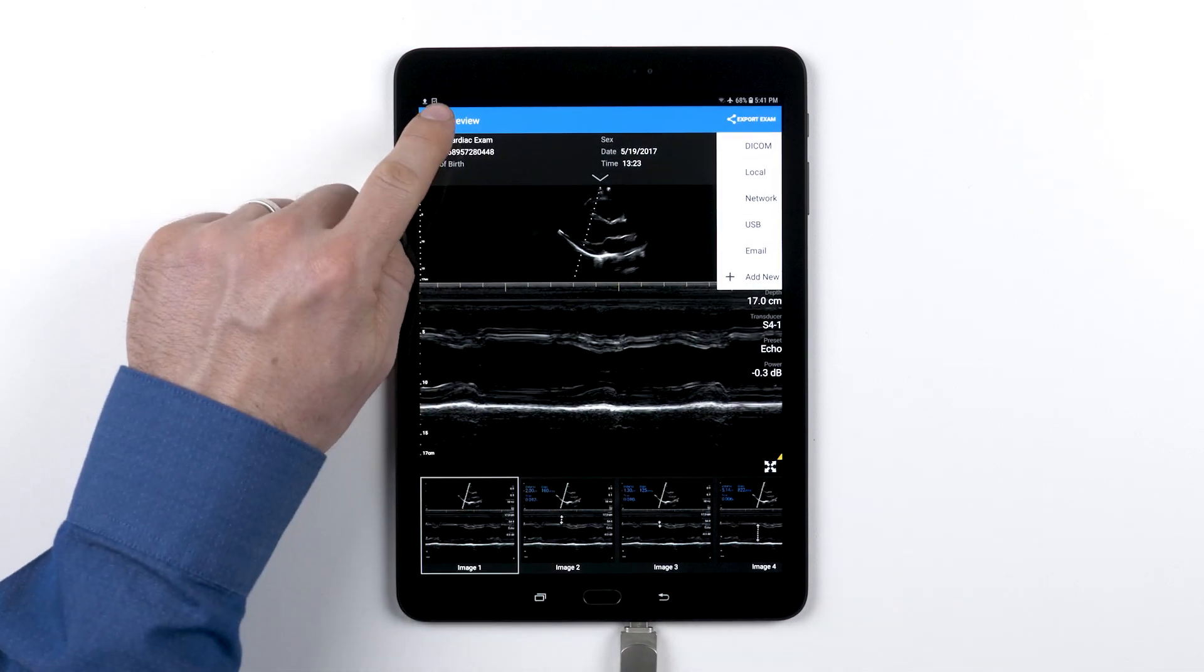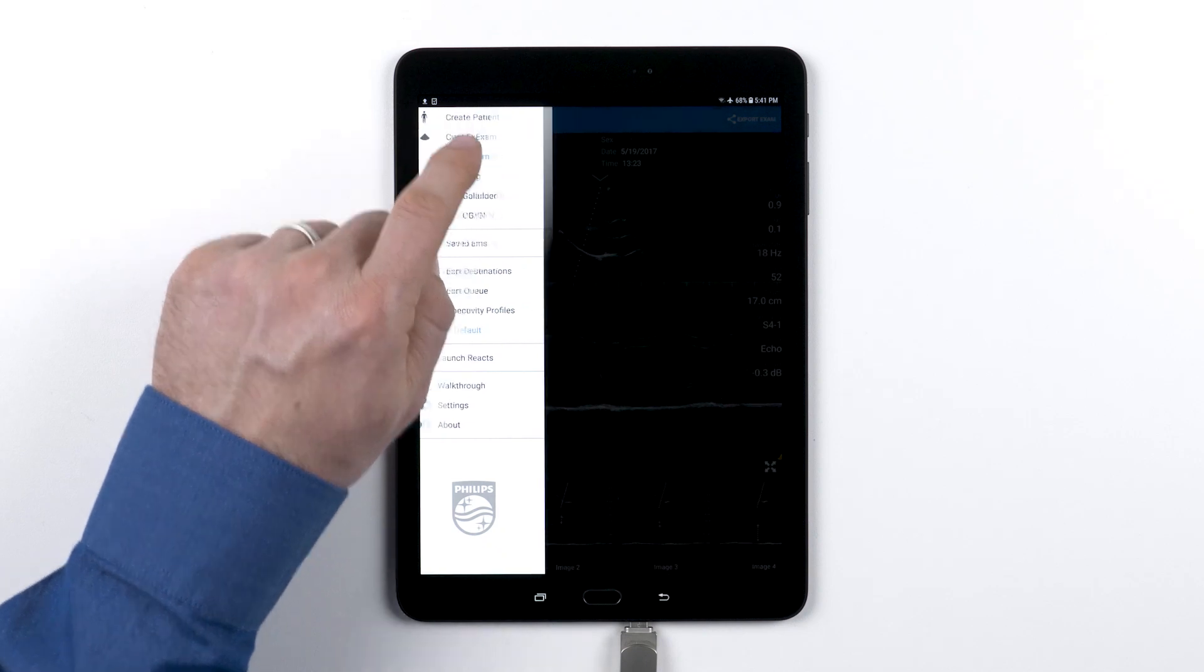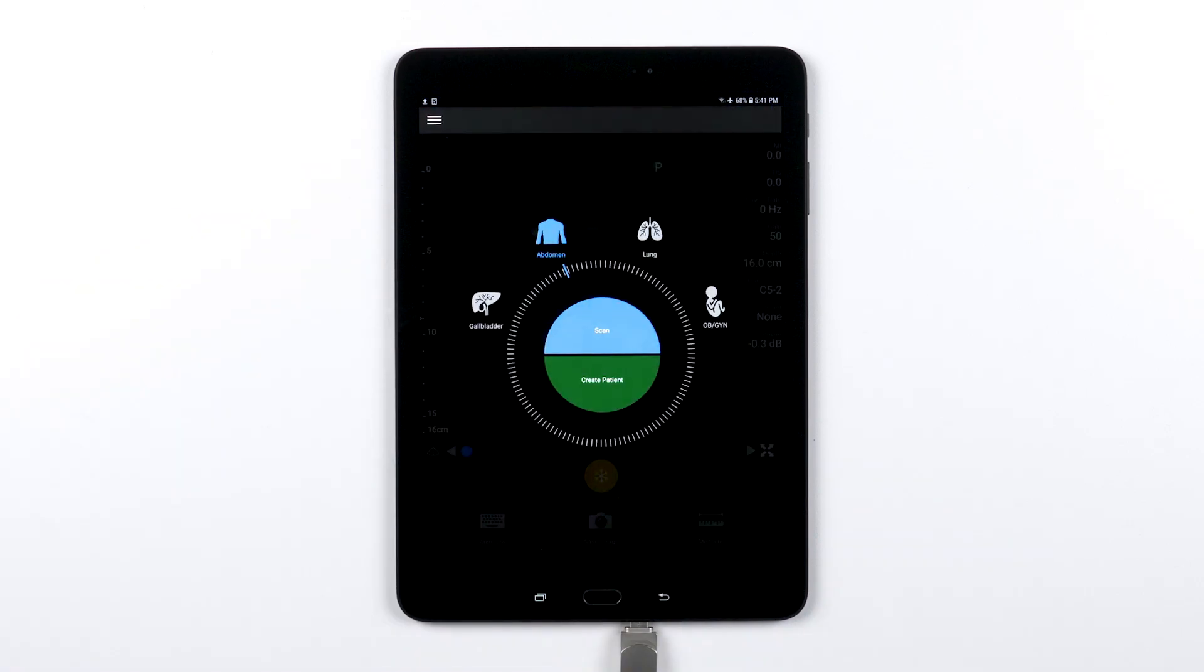Now you should be familiar with how to export your saved exams to one of the export destinations you set up.